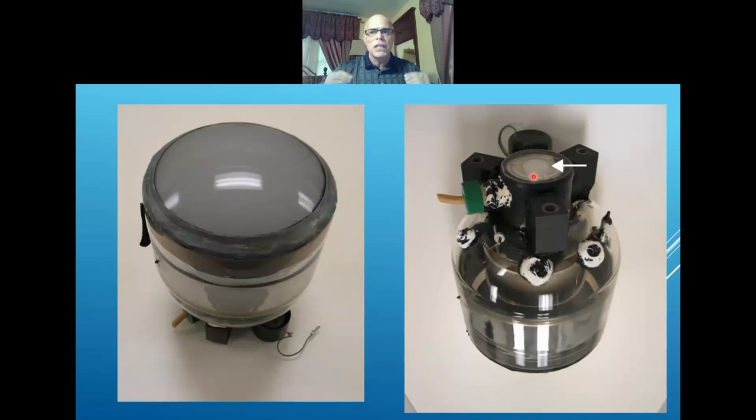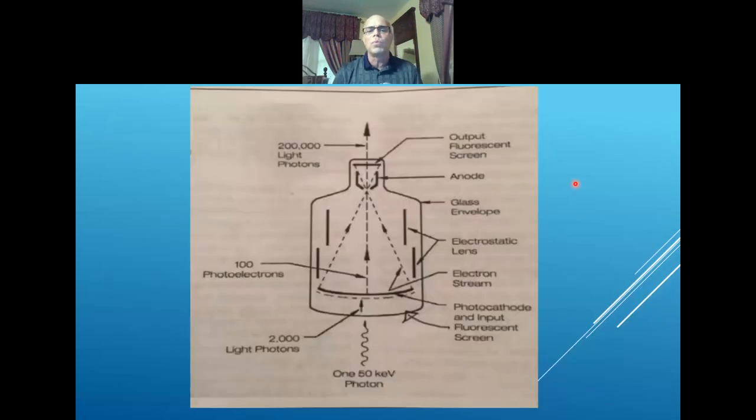It sounds very similar to the X-ray tube, because we're taking those X-rays, we're slamming them across. This has a photocathode and an anode in it. We'll talk about those components in just a few minutes, but it's very similar to an X-ray tube, but it's got a few extra steps involved. So this is the schematic that I thought would really help, and I hope it brings it to light for you before we get into all the specifics of the chapter.